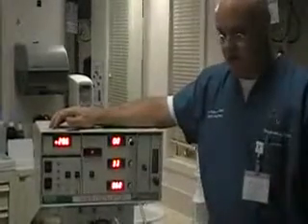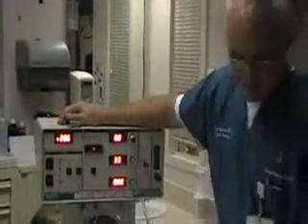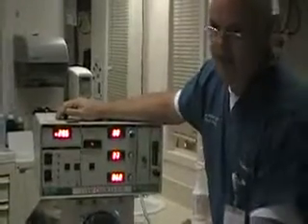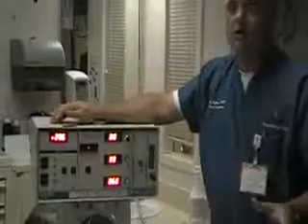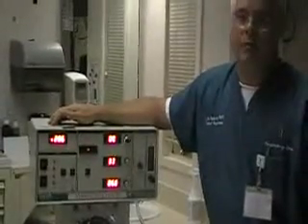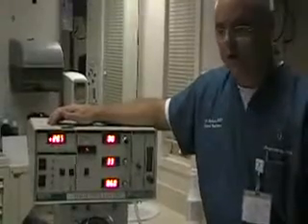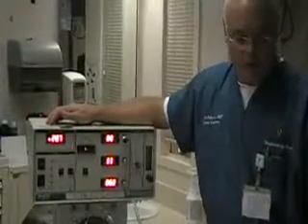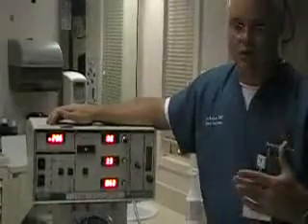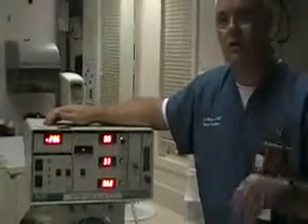One other thing that I wanted you to remember: when you use any of our ventilators, you always want to make certain that you have an inline suction catheter. I've seen this happen before where we've started an oscillator on someone and had to stop and break the circuit to put an inline suction catheter in place. And when you break the circuit on one of these, you de-recruit. So you have to make sure that you have everything ready ahead of time so that when you start the oscillator, you're maximizing lung volume right away.